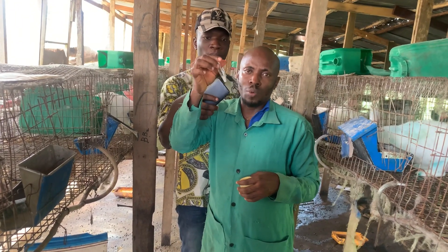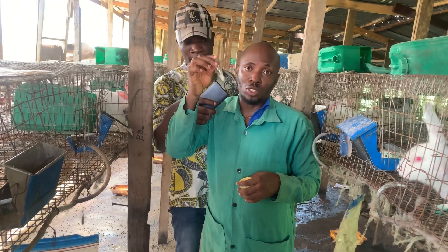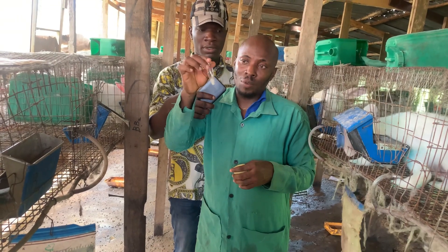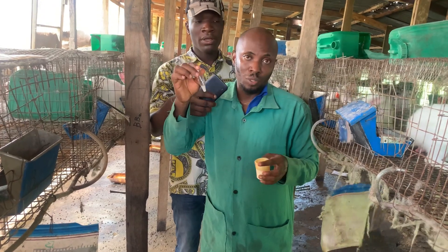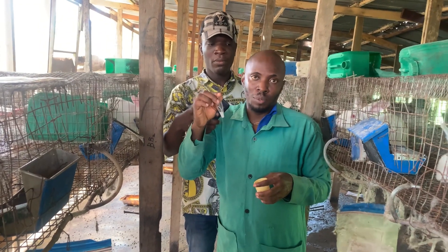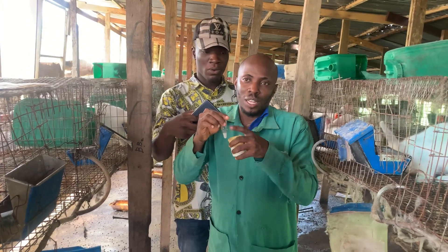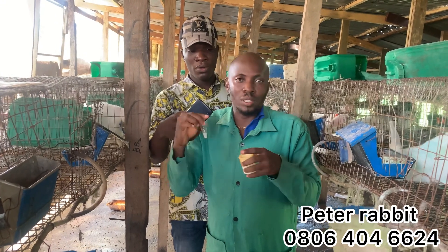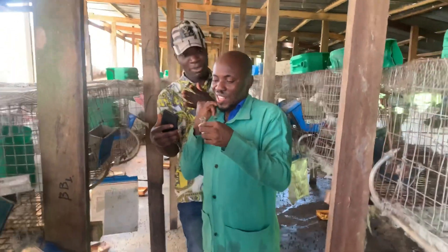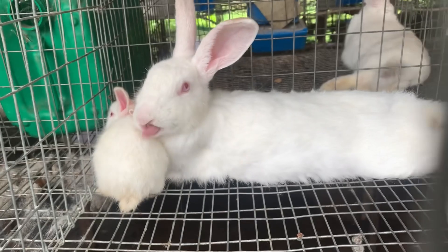The truth is this amount is okay for one female. This is just one ejaculation, so it's going to be at least three times to have enough. One semen like this is enough to impregnate a female, but because you are using the artificial inseminator, you want to use one and inseminate as many as possible. There's what we call semen extender — we are going to add it to increase the volume so that you can use it for at least 10 to 20 females. This little semen from one male can be used for 20 females.